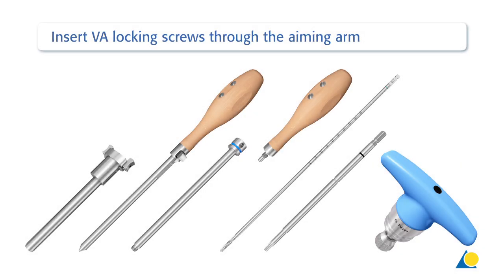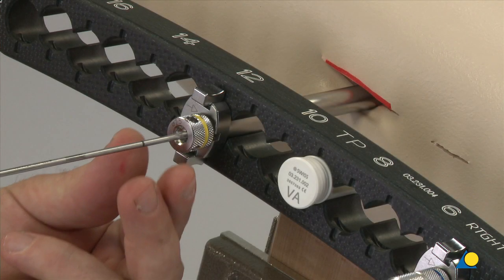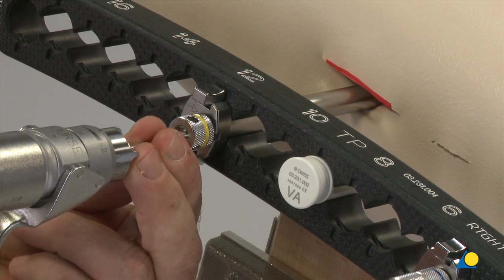The instruments needed to insert variable angle locking screws through the aiming arm are the guide sleeve, the trocar with handle, the 4.3 mm drill guide, the handle, the 4.3 mm calibrated drill bit, the T25 star-drive screwdriver shaft, and the T-handle with torque limiting function 6 Nm. Remove the guide wire and wire guide.